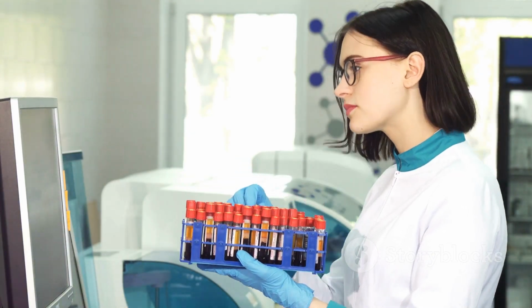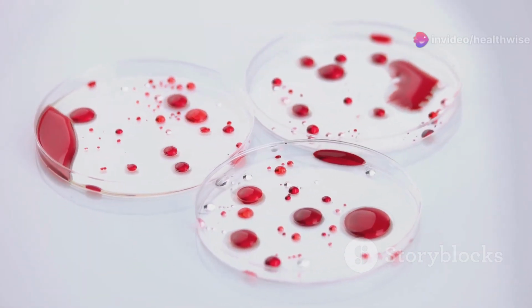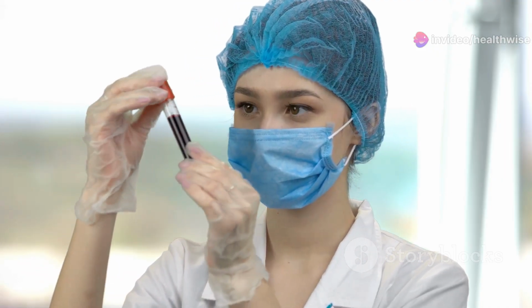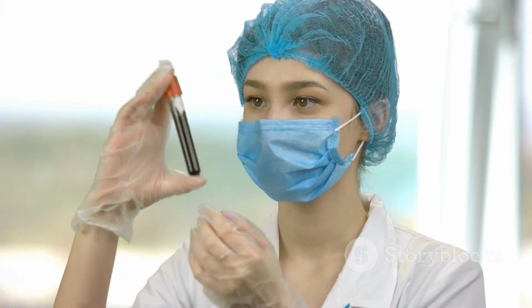Now let's address a common issue: contamination with blood. If there's gross contamination, blood-derived leukocytes will be present in the CSF, so you'll need to correct the count. Here's how you do it. You'll perform RBC and WBC counts in both CSF and peripheral blood.